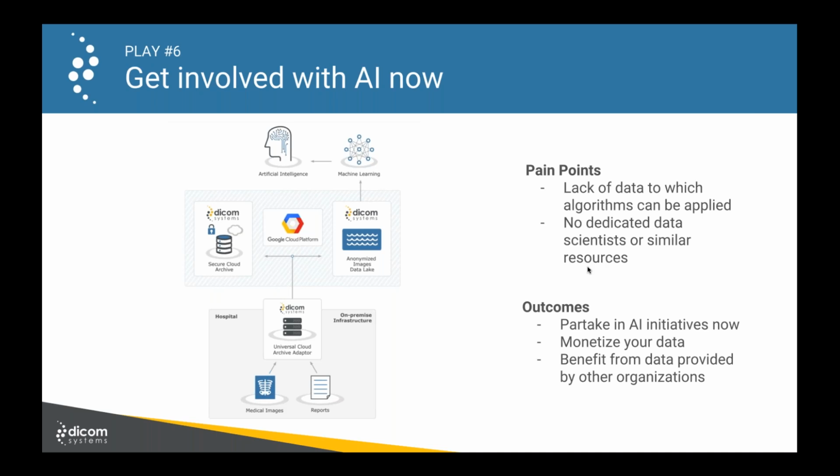And so you can't really take a deep learning approach for medical imaging. You still need to label images and tell an algorithm what it's looking at 100,000 times in a row with different images before it becomes reliably able to recognize what anatomy it might be looking at on a new image.